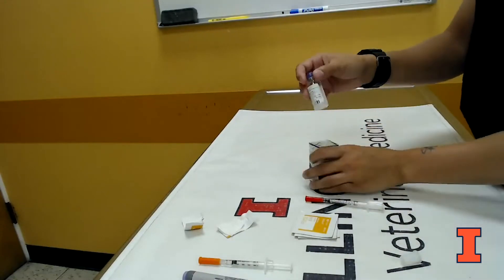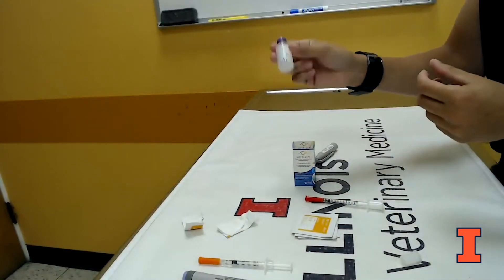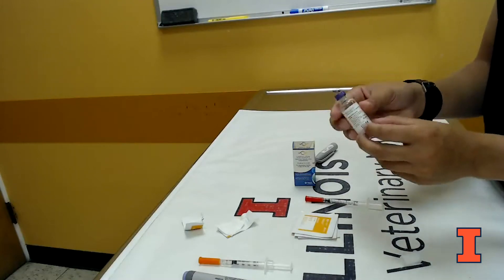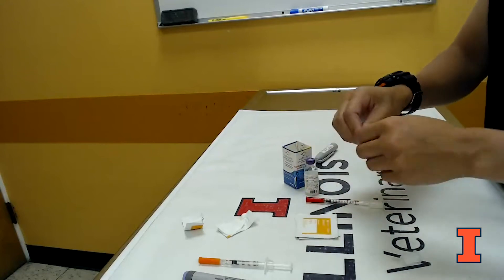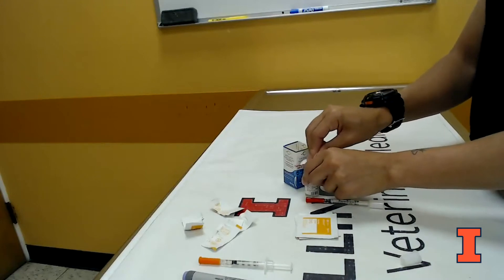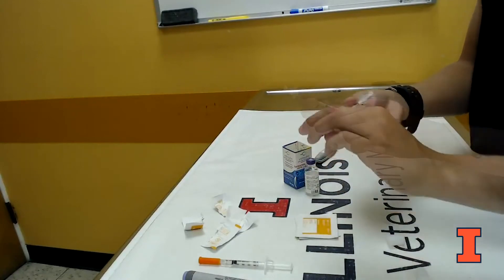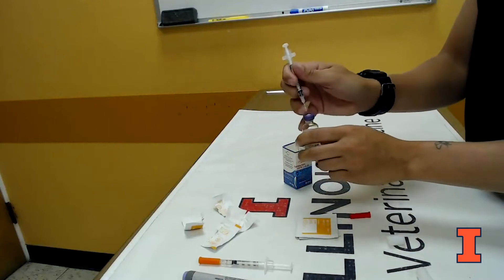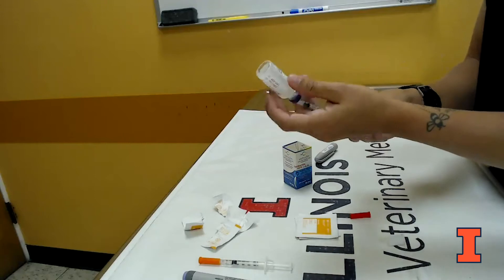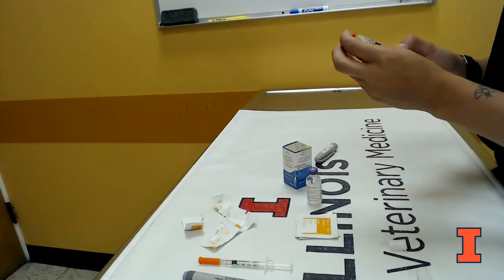For the Vetsulin, it's already in a vial. It's cloudy in nature, and this is one that you would shake well. Some insulins will ask you to roll gently rather than shake well, so you should always look at the package to see what you need to do. Again, swab the top if you have an alcohol swab available to prevent contamination. Then take the cap off the end of your syringe, insert the needle into the vial, and draw up the dose for your pet.